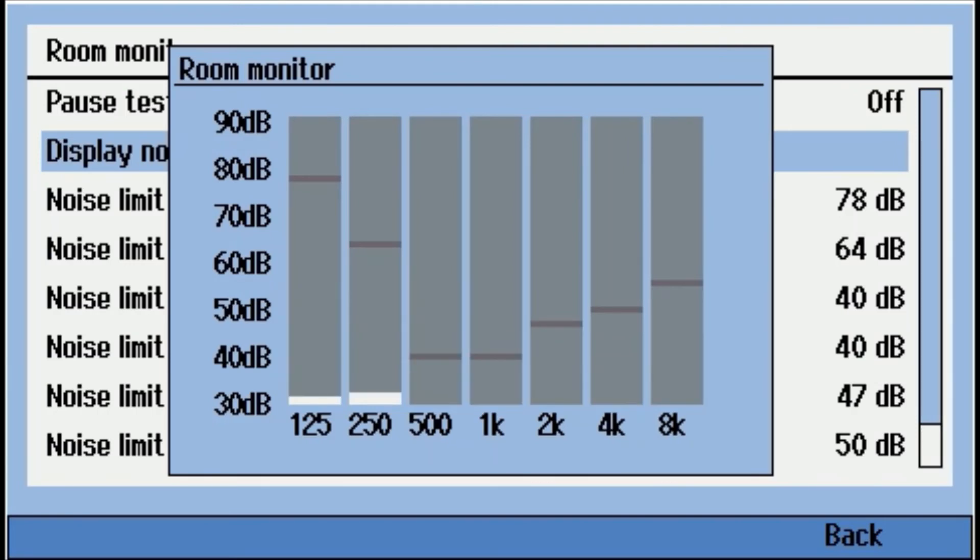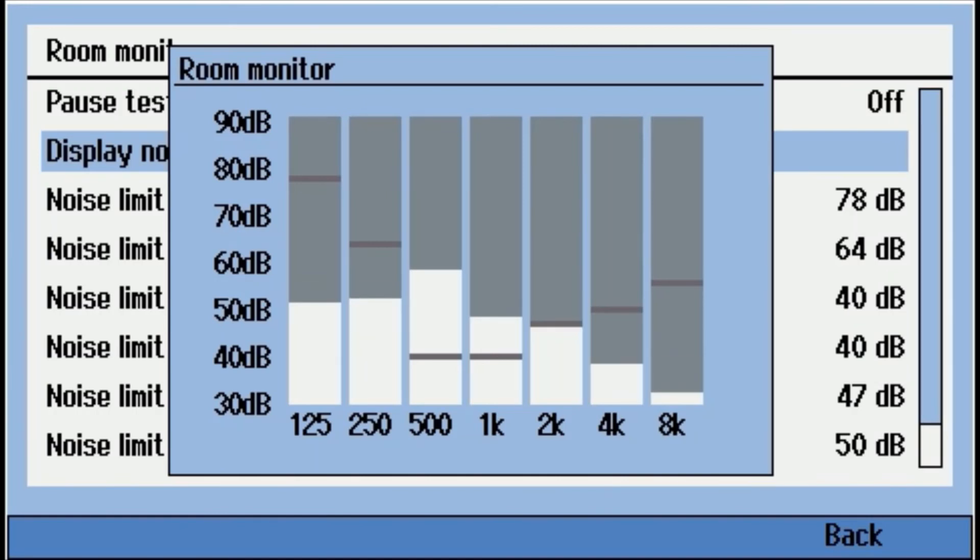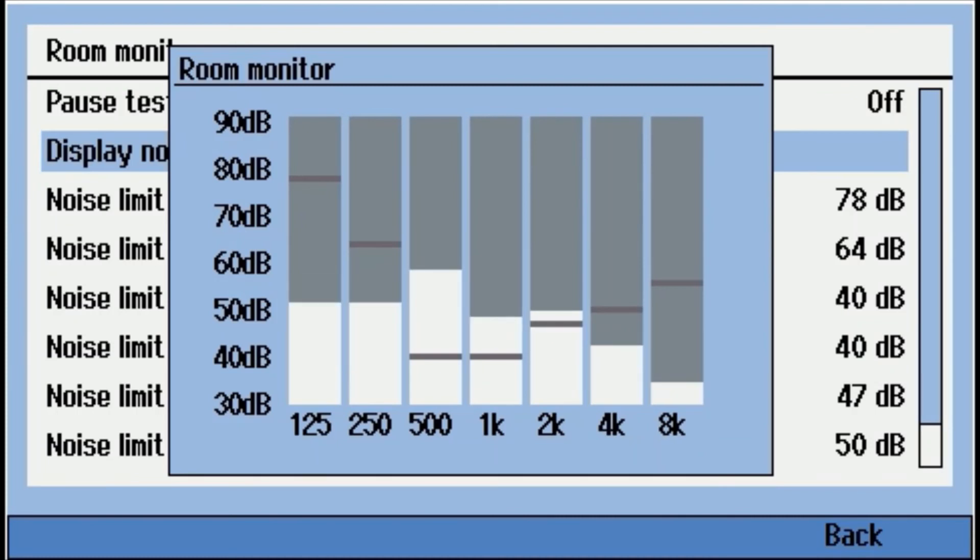So what this will do, if you're testing, let's say you want to test away from a booth, it gets too loud. When it's too loud, it'll pause the test. And then as soon as it gets quiet again, it'll resume the test. So the operator doesn't have to do that. The audiometer's programmed to do that automatically.